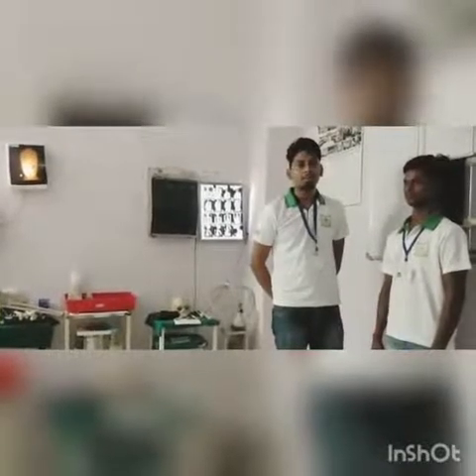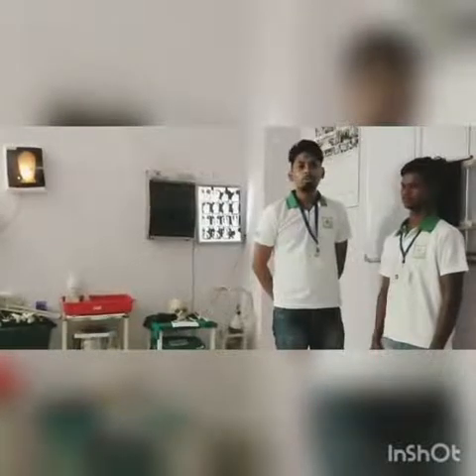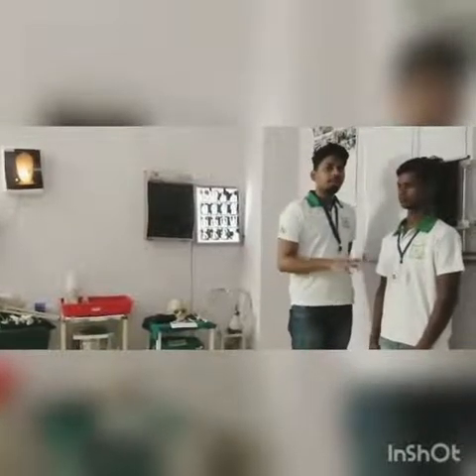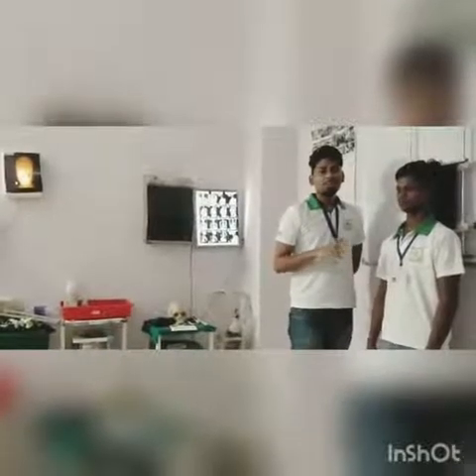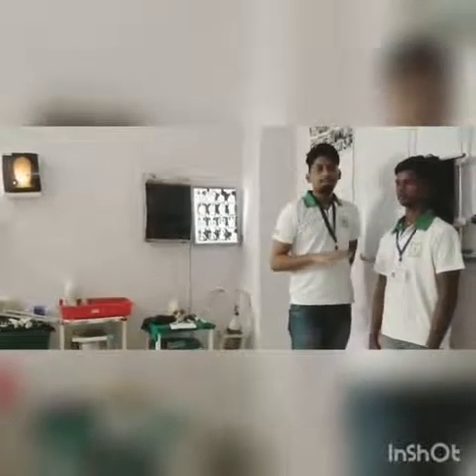The routine views of the cervical spine are AP and lateral. For the AP, that is anterior-posterior, which means from front to back, we will first ask the patient where he is having any issues, and we will try to make him comfortable so that he doesn't get scared or frustrated or irritated by the procedure. That will help us in smooth proceeding.